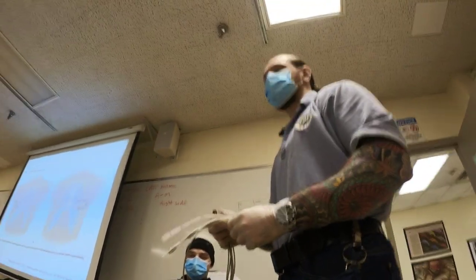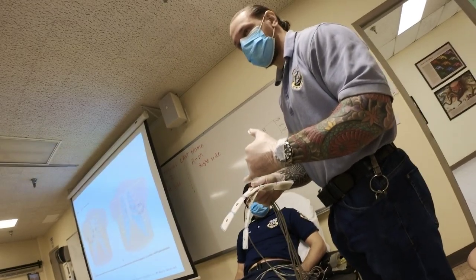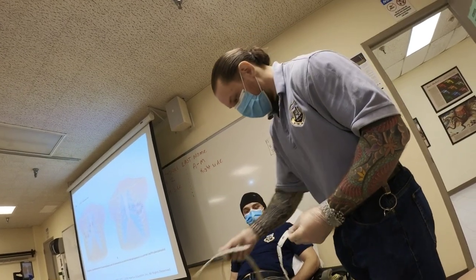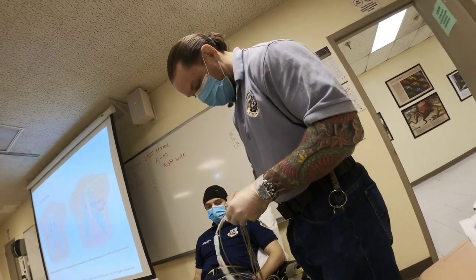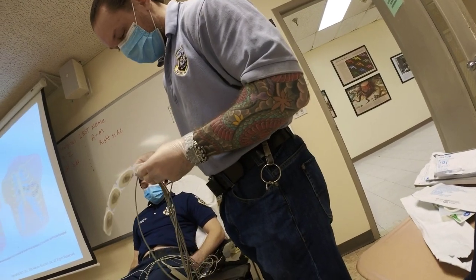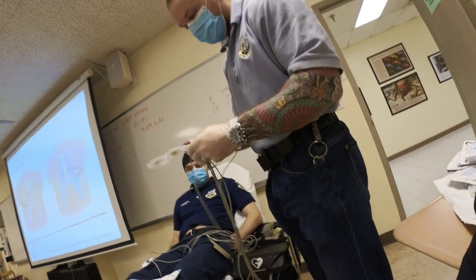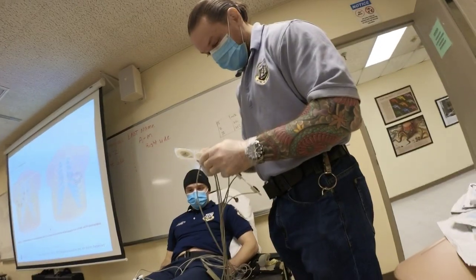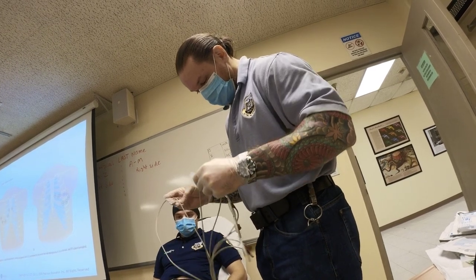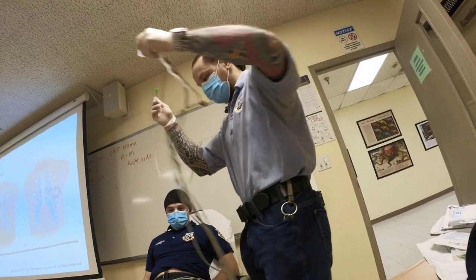When I would do interfacility transport with a balloon pump, I would definitely put some conductive gel into those because I want to make sure my balloon pump functions really well, right? So connect these, make sure they snap on, and do not do this on the patient's chest. You notice I'm connecting them before connecting to him. And this was your ground. This was the green one that I said was the ground.